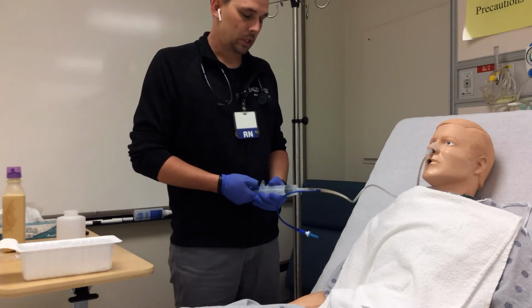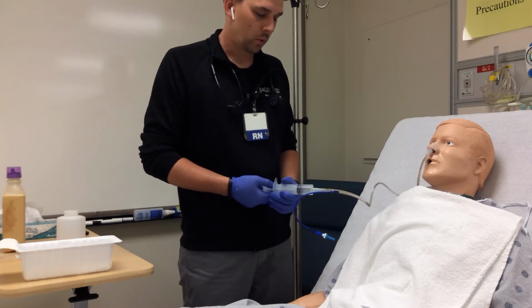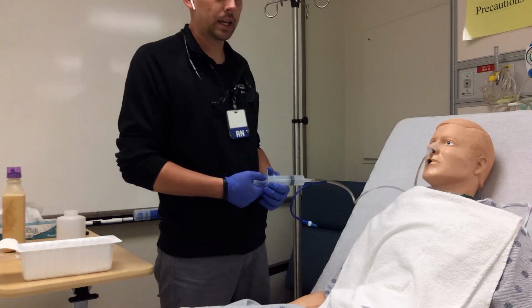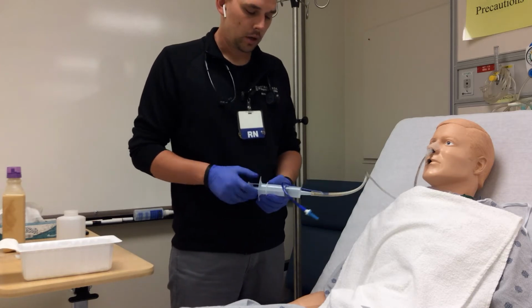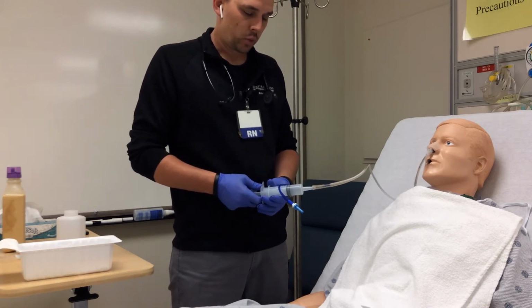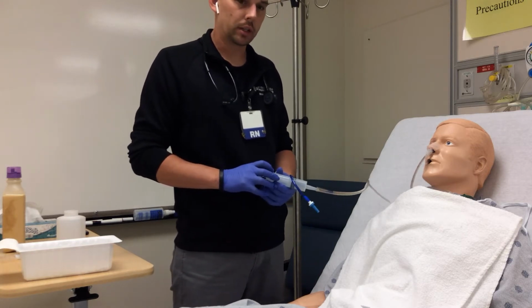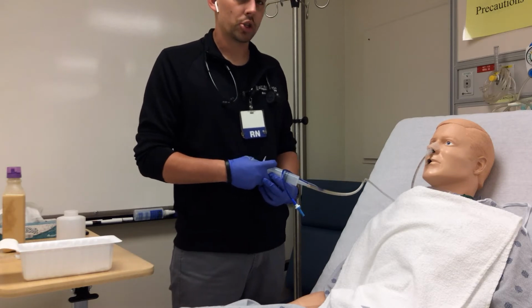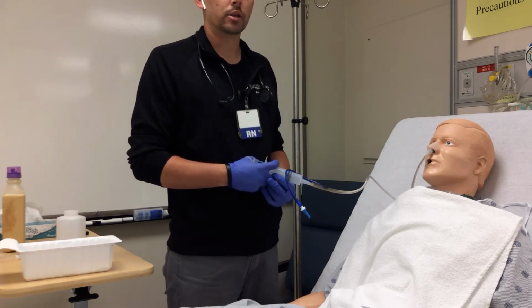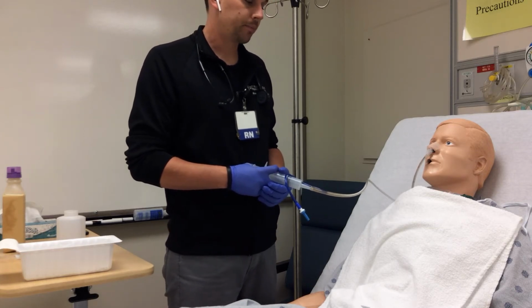While we're at it, we're going to continue to pull back, and we are going to check for gastric residual volume. We're doing this before initiating any type of feeding, and then routinely if they're getting continuous tube feeding. So keep in mind, anywhere between up to 500 mLs, we want to make sure we are returning to the stomach to maintain that fluid and electrolyte balance. But again, making sure we're checking our institutional policies and understanding what our policies and procedures say is appropriate.